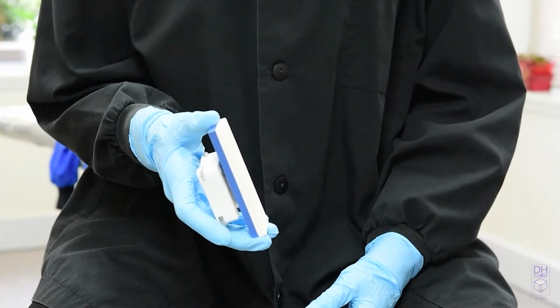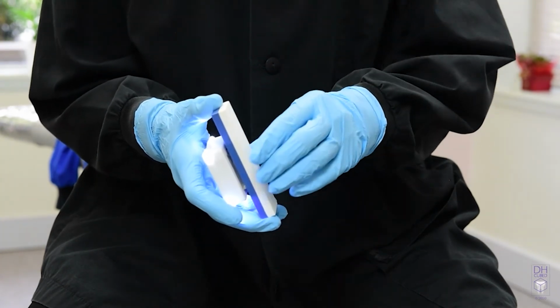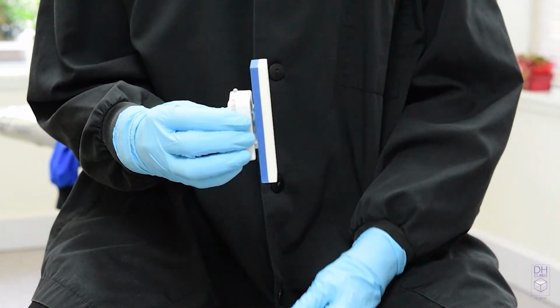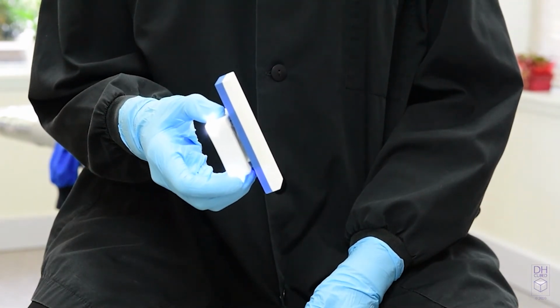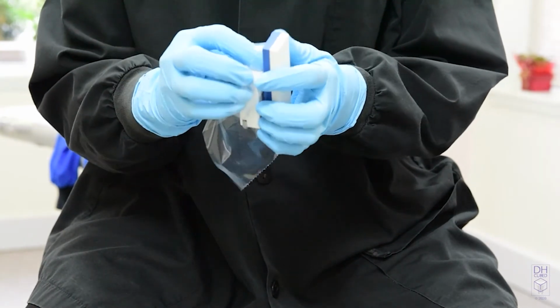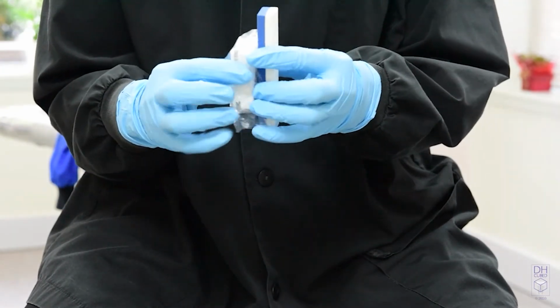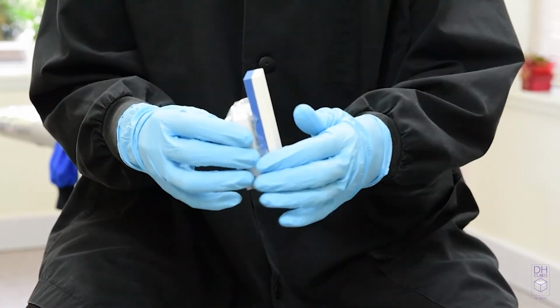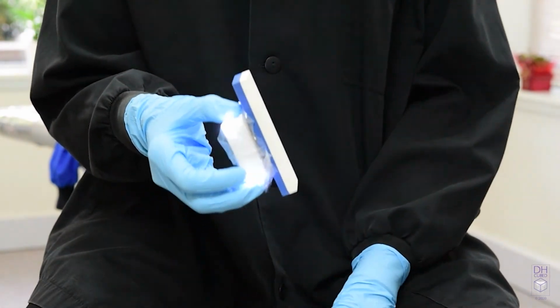Many industry experts do not want you to hold the stone this way for fear of exposing your fingers to a contaminated instrument. So what you can do is hold the 110 either on the side so your fingers are clear of the stone, or you can hold it on the top, but you will need to use a barrier. One of the barriers that you can use is the barrier that you use on your light switch handle or your X-ray button. It just wraps on there. And again, you can hold it on the side, or you can hold it on the top, and you're ready to go.